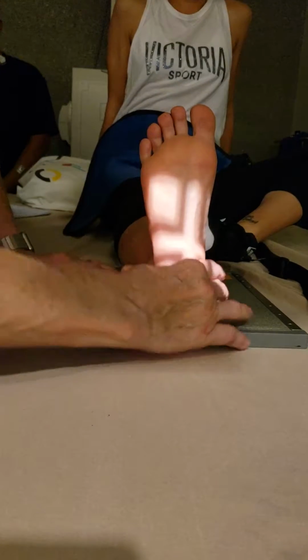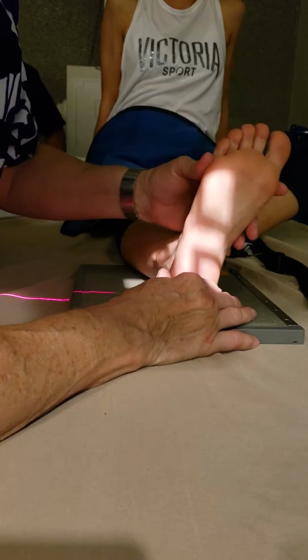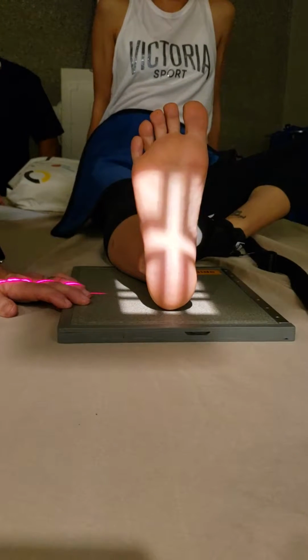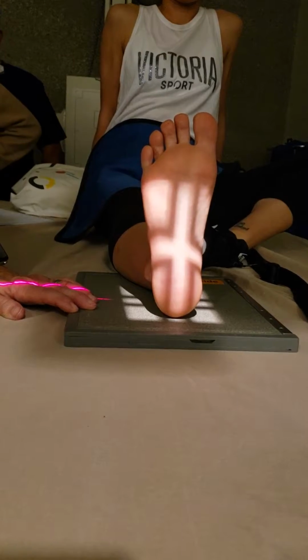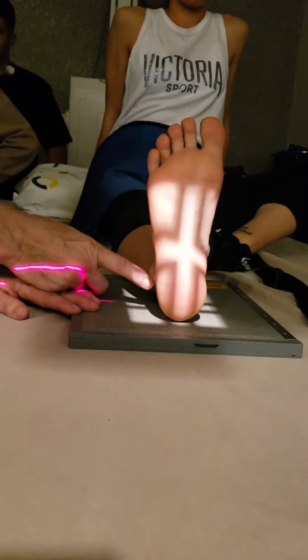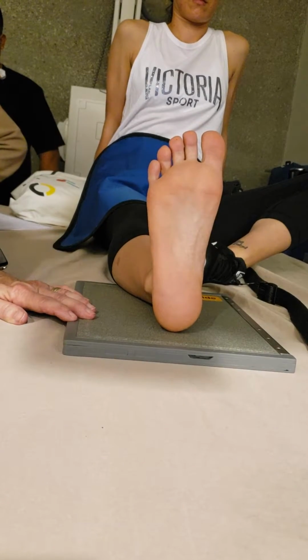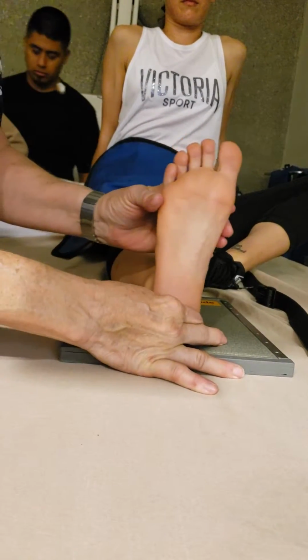The other thing you want to make sure is that the foot's straight up and down this way. Don't let it go this way or this way. Because remember that one image where we saw the tibia, or the fibula rather, in the image, it was because the foot was rotated. That one. See that? So we don't want it to go out to the side. We want it straight up and down.